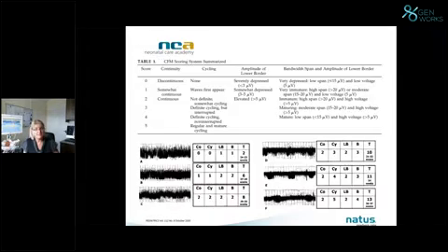And I would highly recommend anybody who has never looked at Burdjalov scoring to pull this paper and look at this scoring system. So basically what they do is they give a score from 0 through to 5 based on continuity, cycling, the amplitude of the lower border, and the bandwidth span.